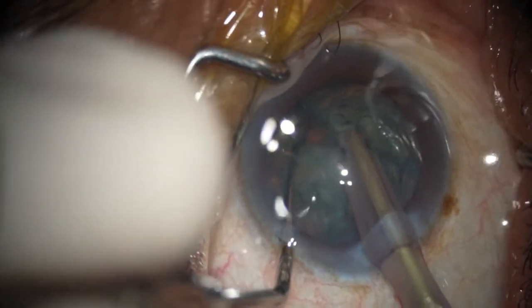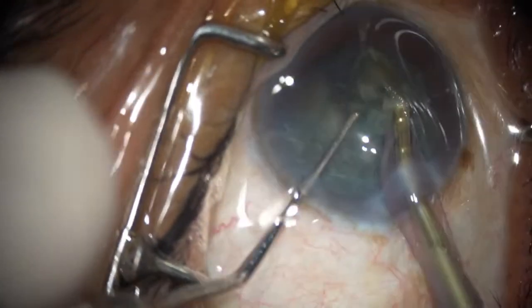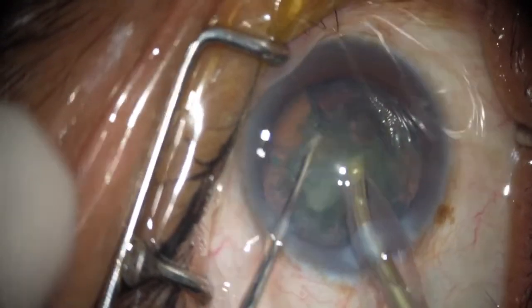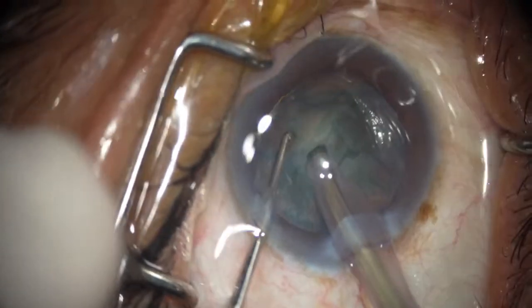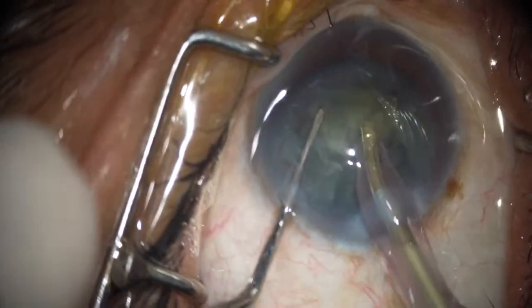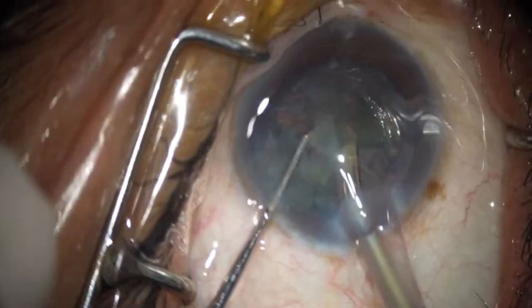So I'll attempt a direct chop. My settings are around 450 vacuum, 42 aspiration, and bottle height is around 80, and power is 40. Now I'll shift to quadrant. The settings will be almost same, except the vacuum, I will increase it by 50. So now the vacuum is around 500.